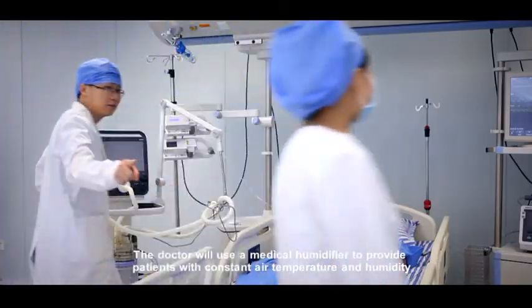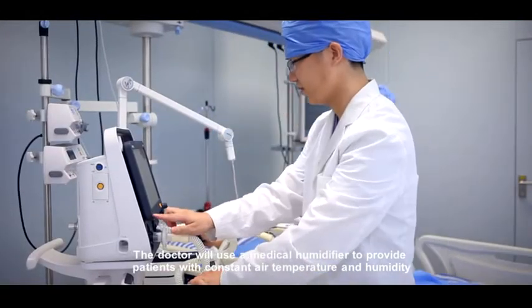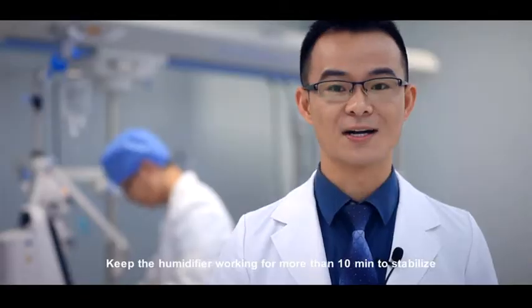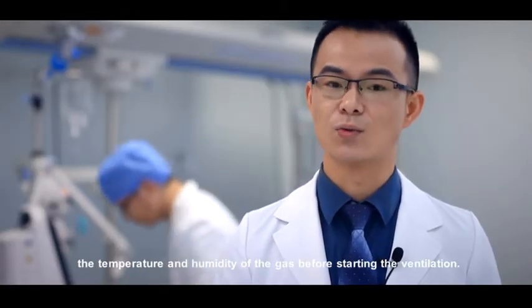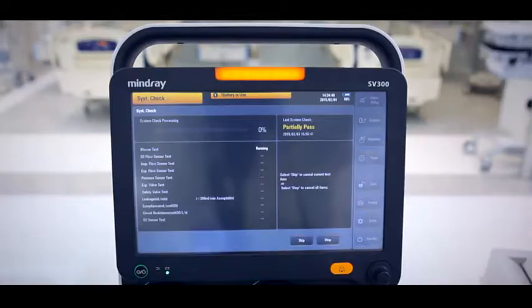The doctor will use a medical humidifier to provide patients with constant air temperature and humidity. Keep the humidifier working for more than 10 minutes to stabilize the temperature and humidity of the gas before starting the ventilation.